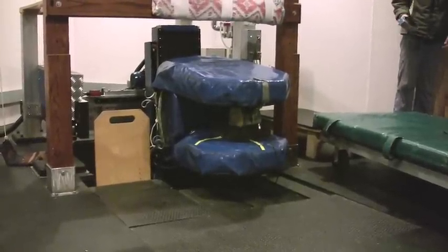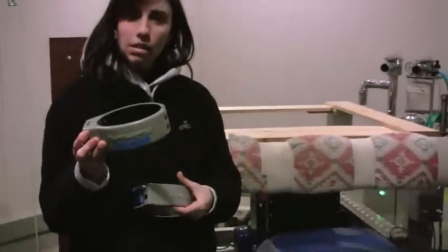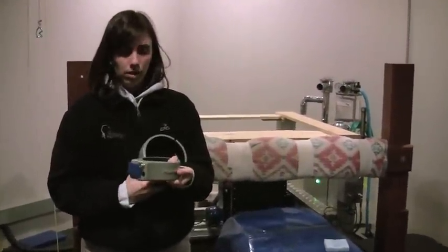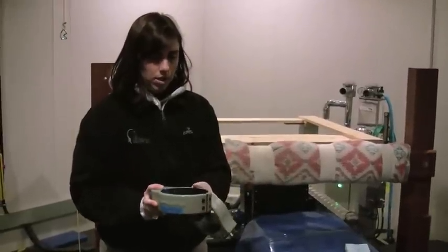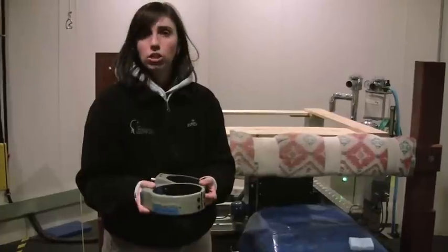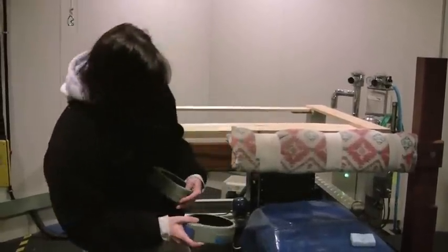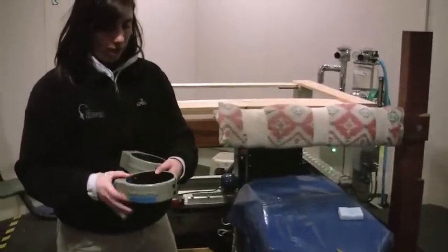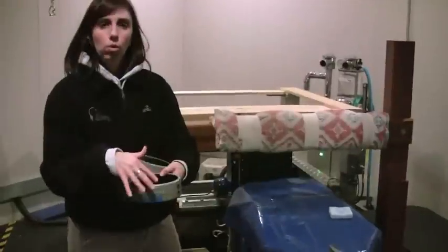Nicole has some of the different coils, depending on the shape. This one is designed more to go around the horse's knee or carpus. This one is a small version, which would go around a fetlock, because you want as close a fit as you can utilize to get a good image without it touching the horse. That's why we've got all the padding, so you can actually suspend whatever you're looking at within the coil.